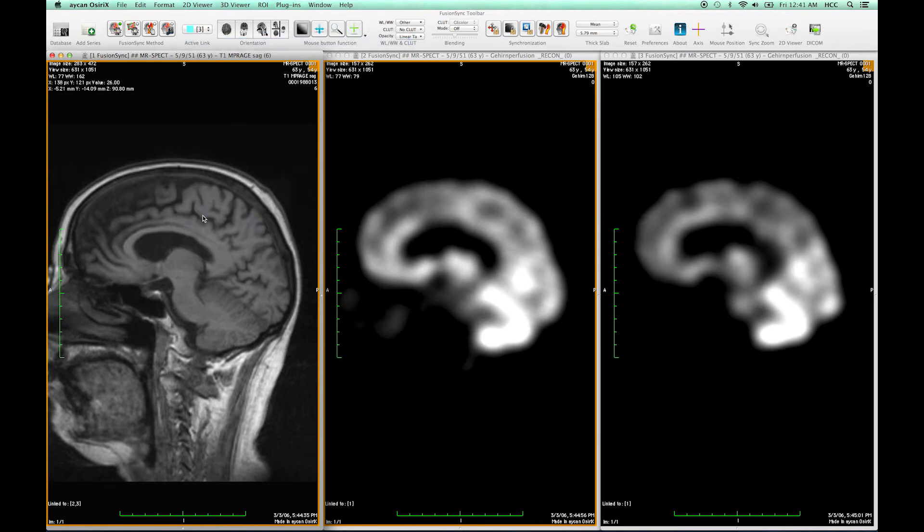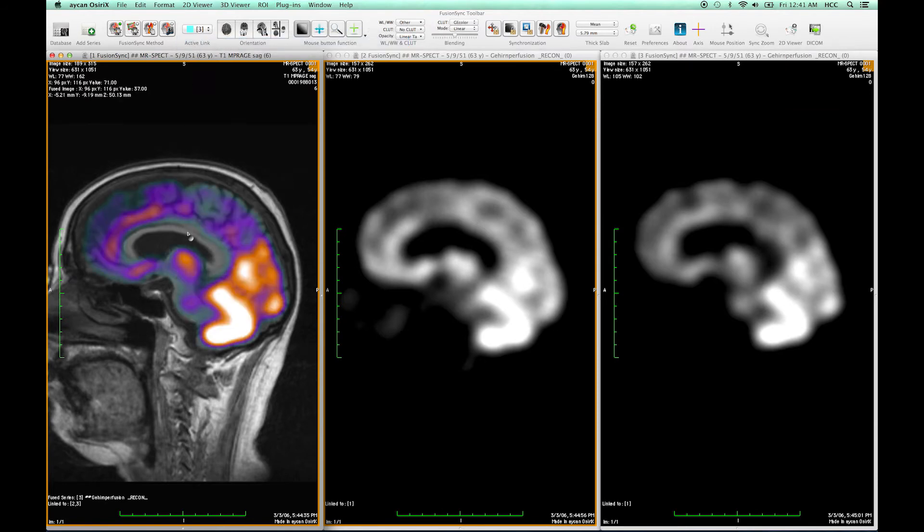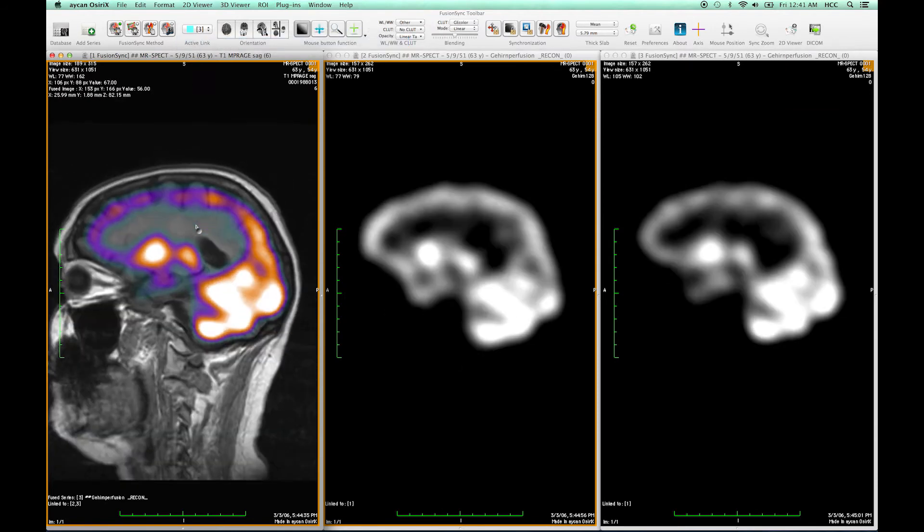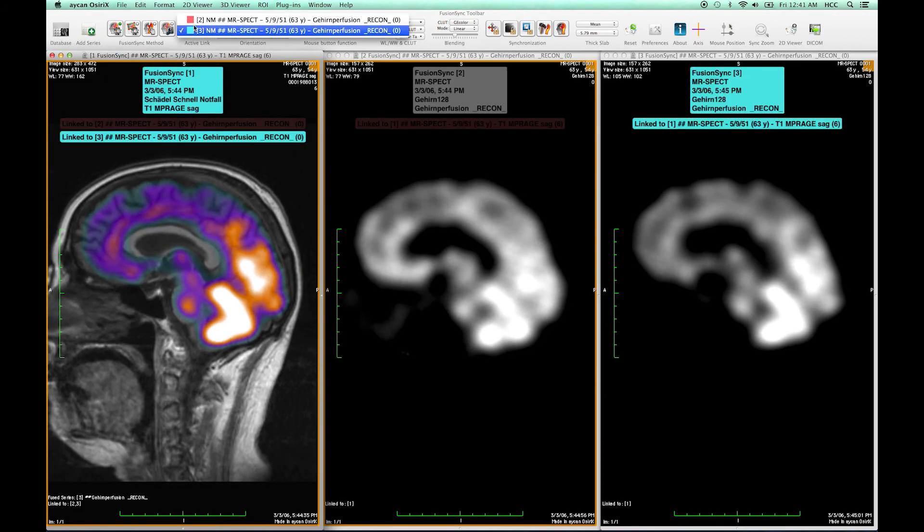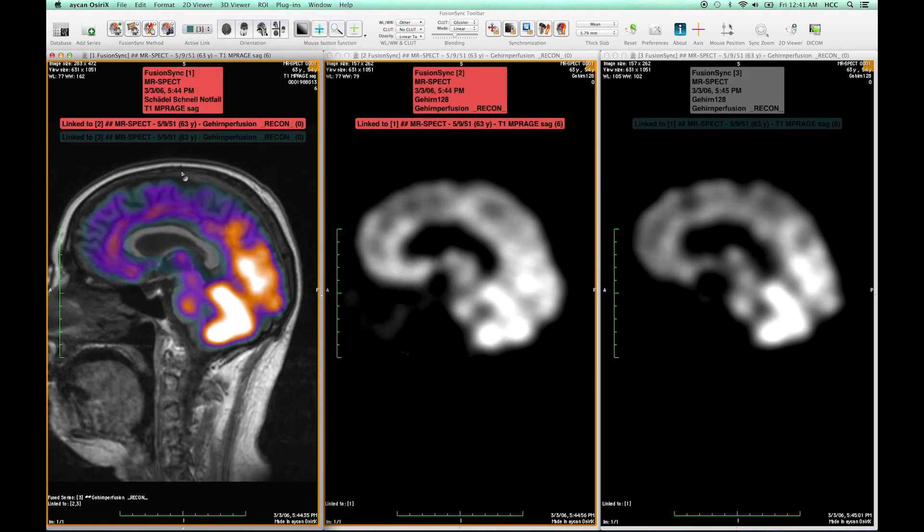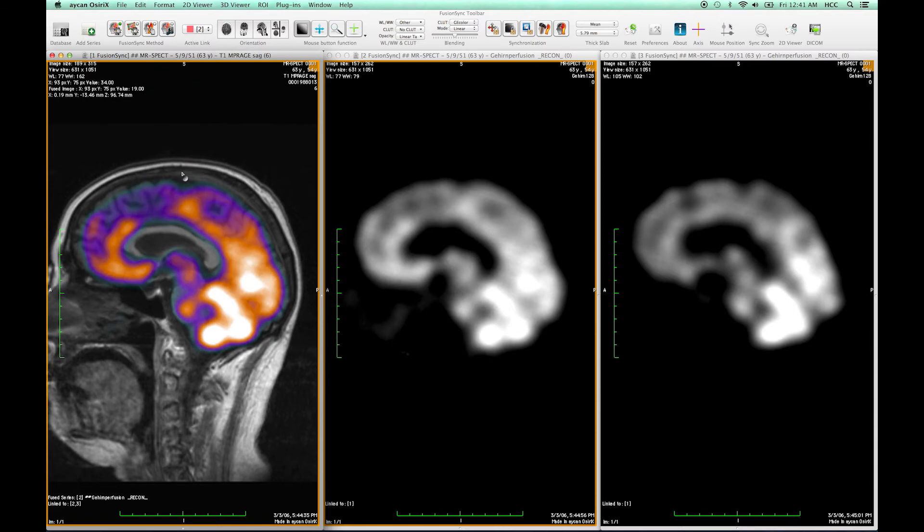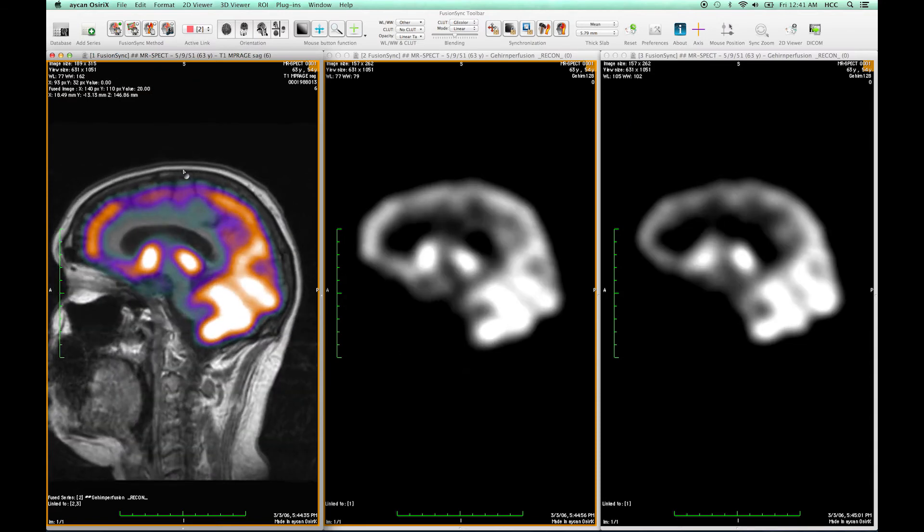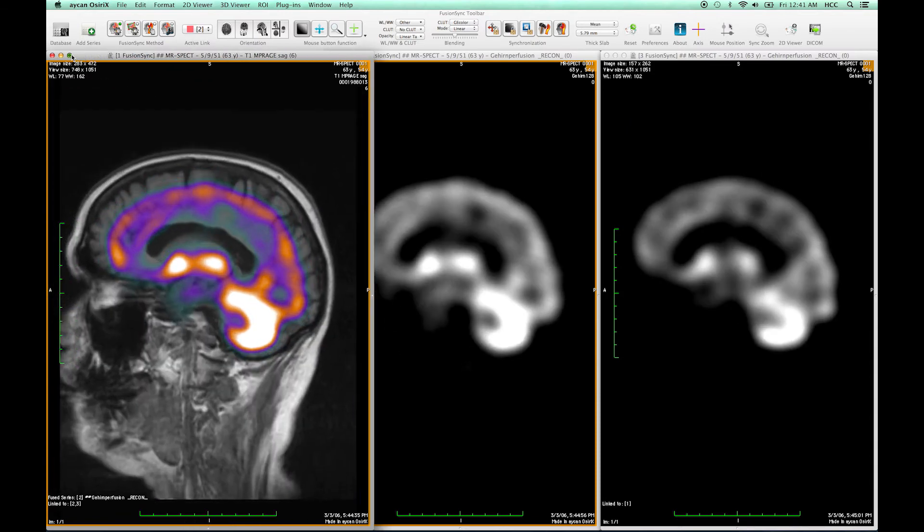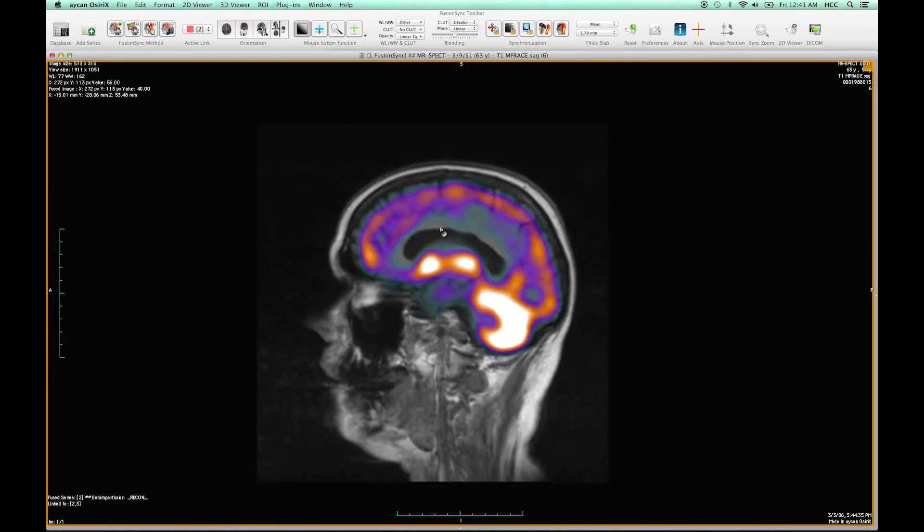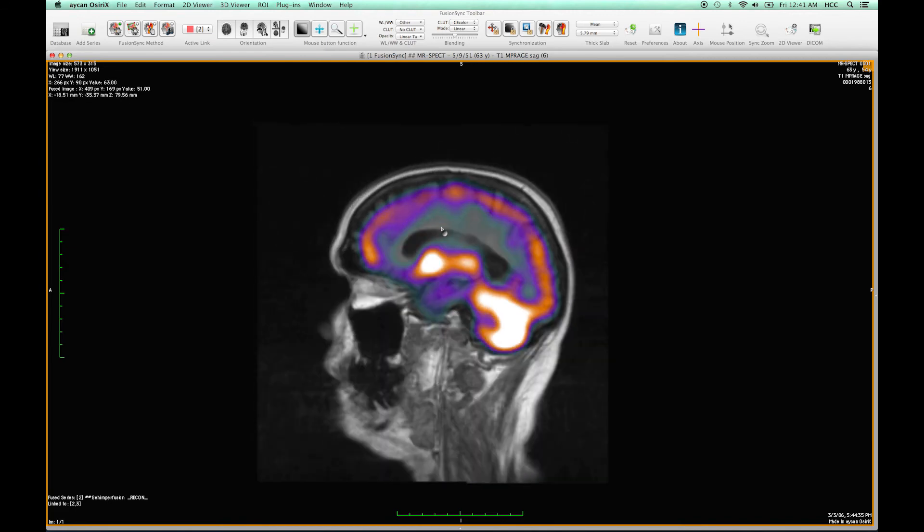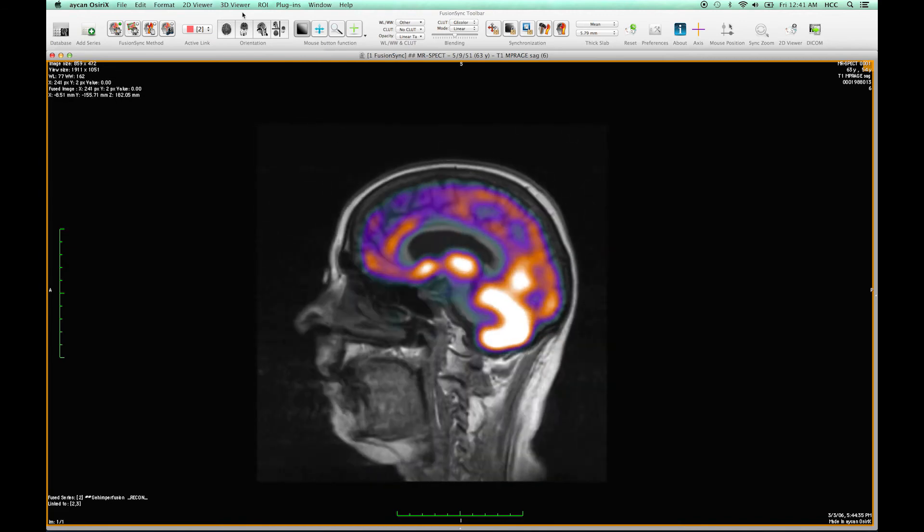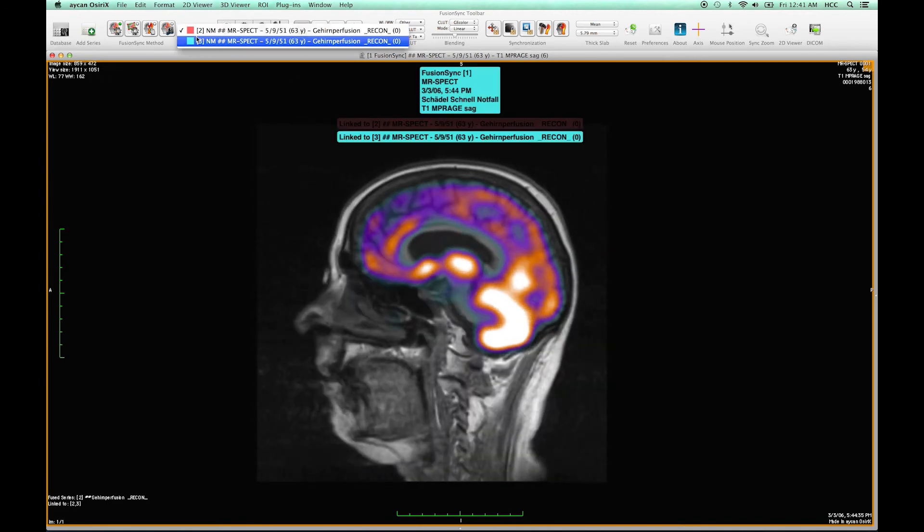I can now enable the blending and switch in the blending easily between the two. This allows me for example to compare specific positions in the image based on one or the other SPECT.